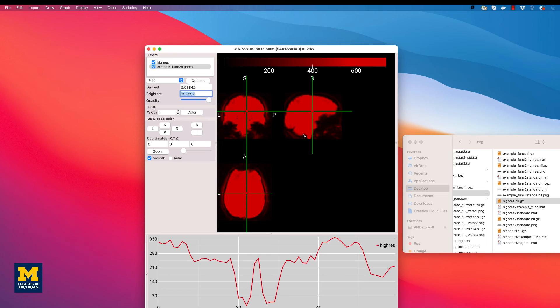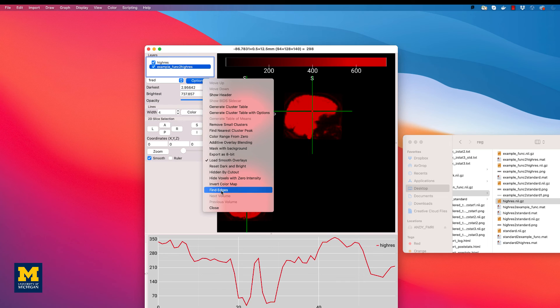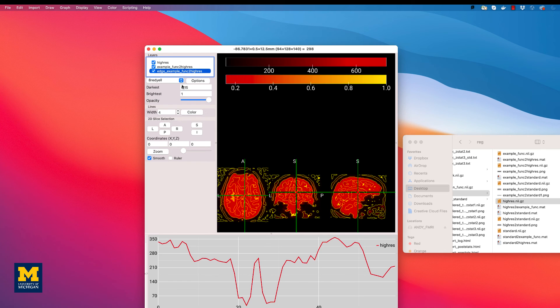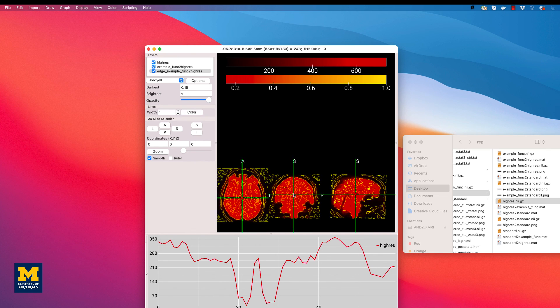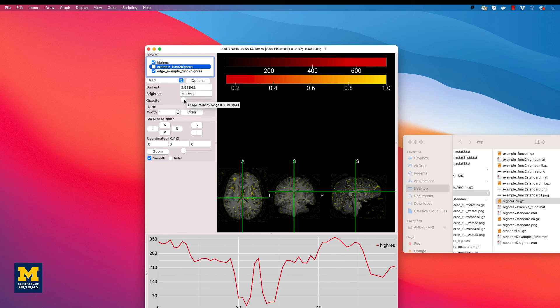However, it is difficult to tell how well some of the internal structures are aligned, such as the ventricles and basal ganglia. To see the edges of features such as the sulci, highlight the example_func2highres image, click on Options, and select Find Edges. This will create a new overlay called edge_example_func2highres. You can see this image more clearly by unchecking the box next to example_func2highres, which lets you see where the edges of the brains are aligned and how well the interior structures match up.